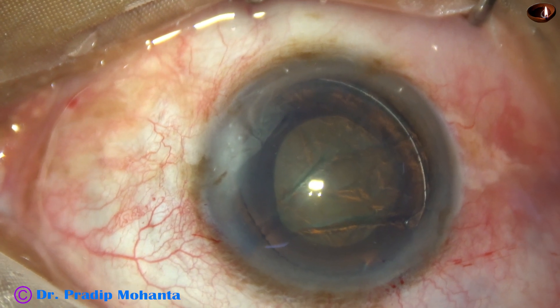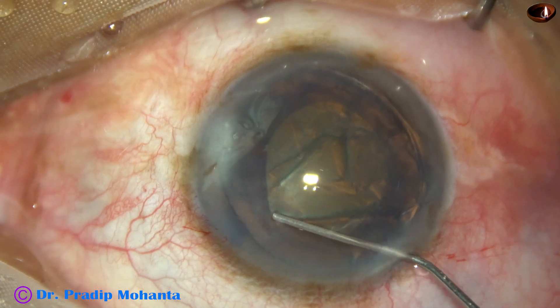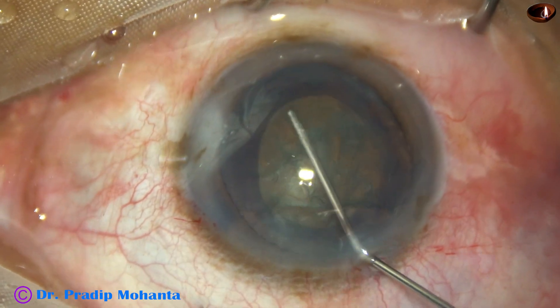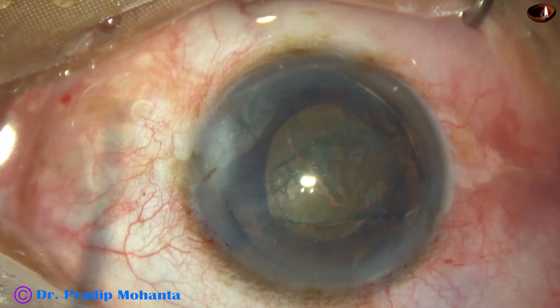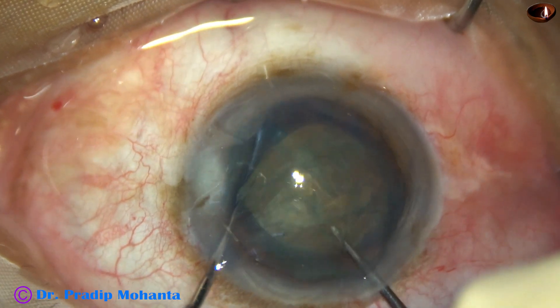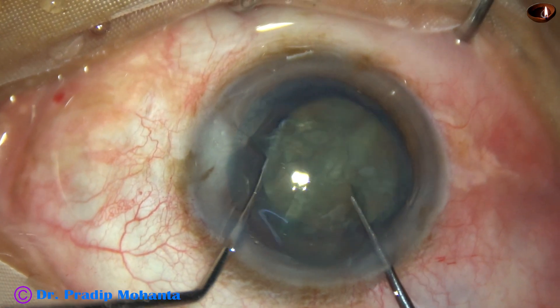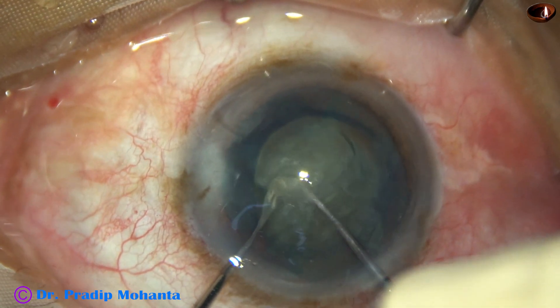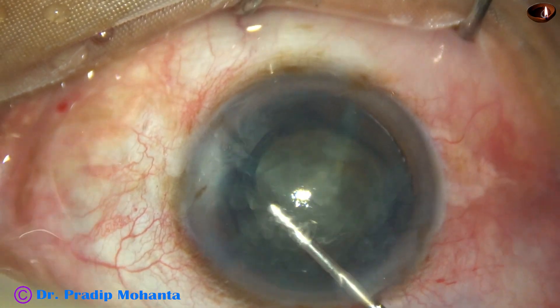Now I inject viscoelastic again. I am planning to divide this nucleus with a pre-chopper — this is Dr. Sohail's pre-chopper — without using irrigation. So what happens? There is no fluid going into the vitreous through the defect, the vitreous is not hydrated, and the lens is divided very nicely into four parts.